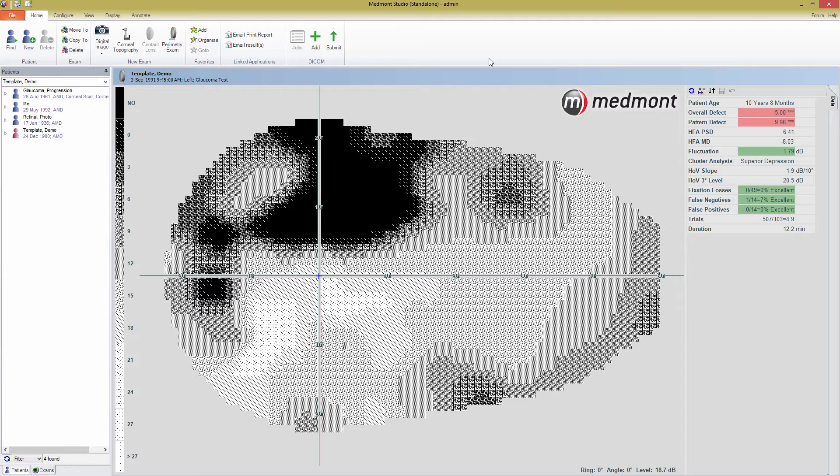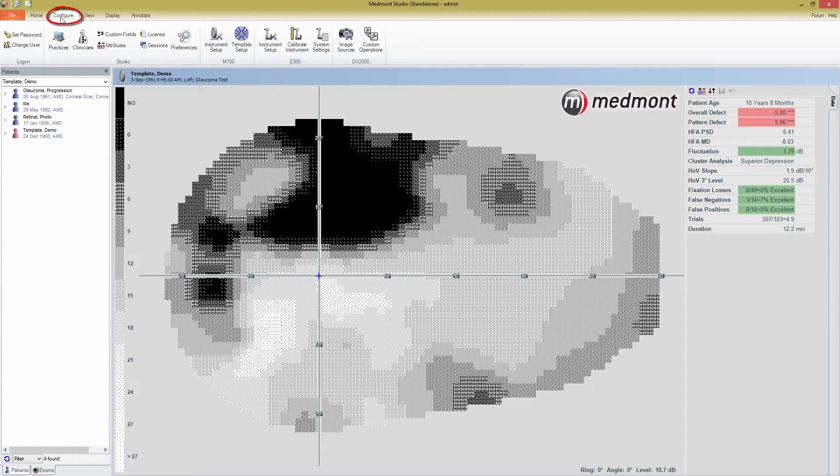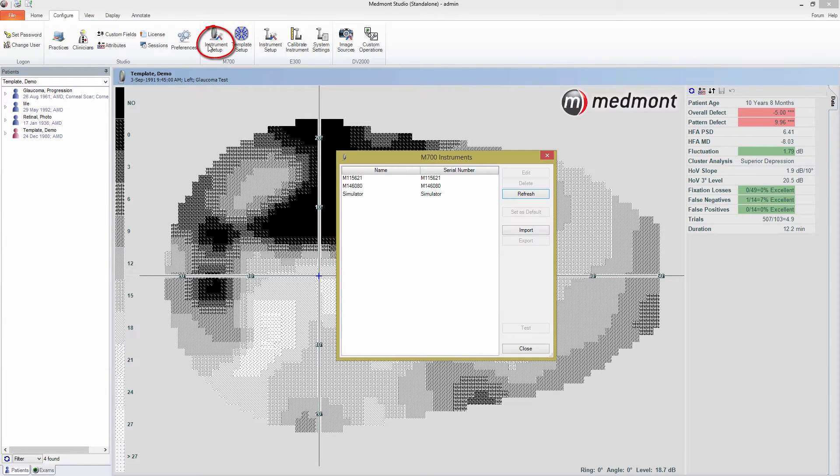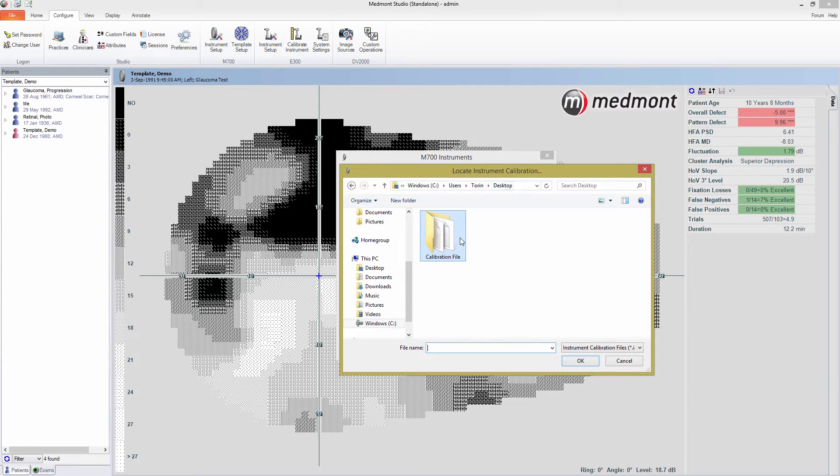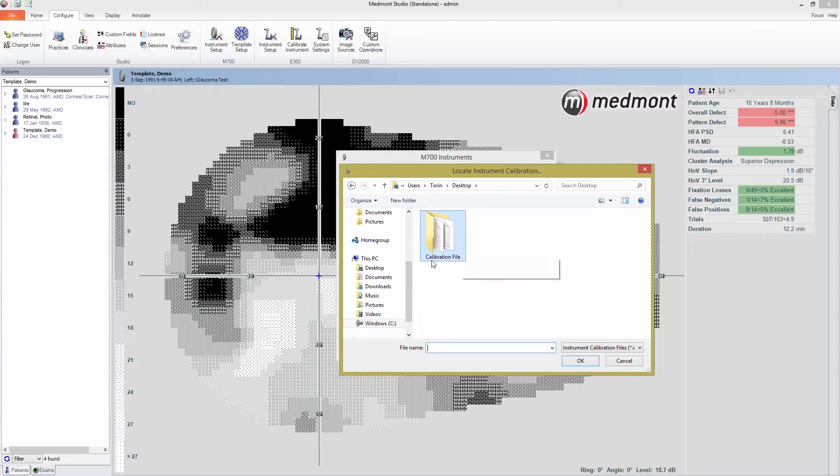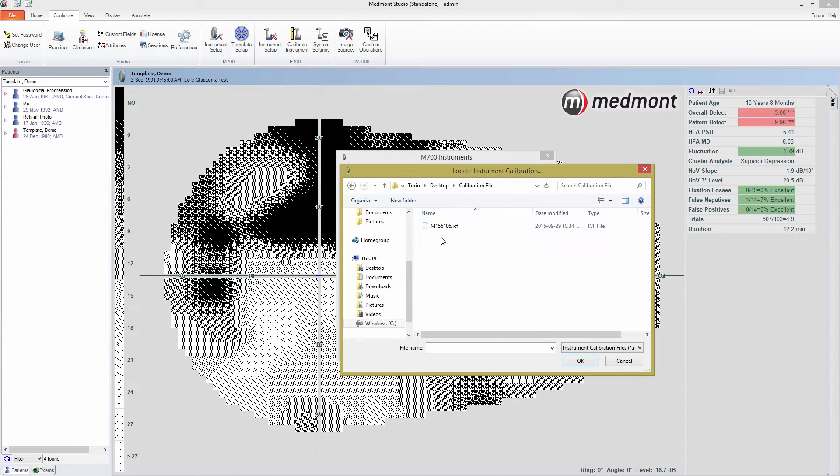If you haven't installed the calibration file yet, this is the first thing you need to do. Go into the Configure tab, press Instrument Setup under M700, and press the Import button. From here, you can browse the calibration file found on the USB key provided with your M700. Double-click on the calibration file folder, select the calibration file, and press OK.